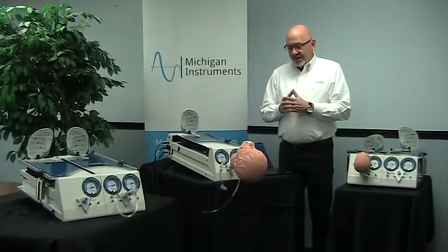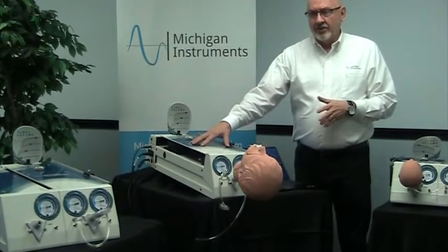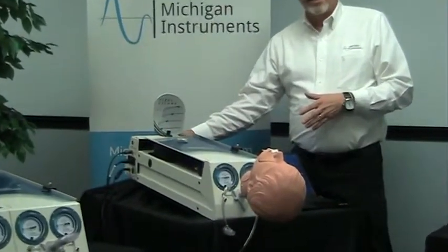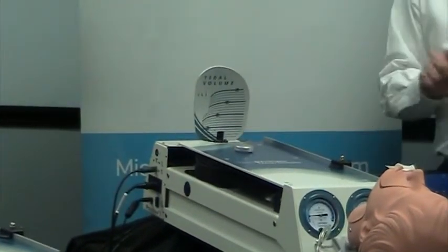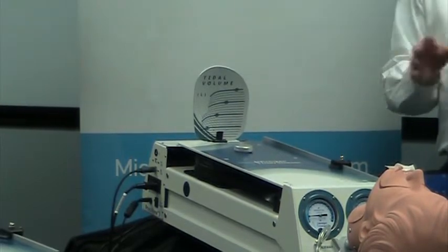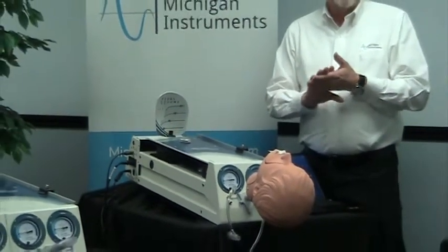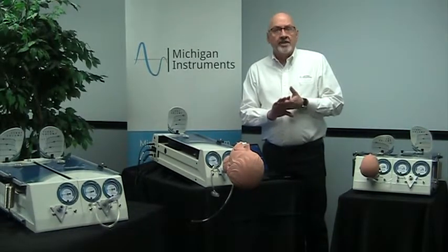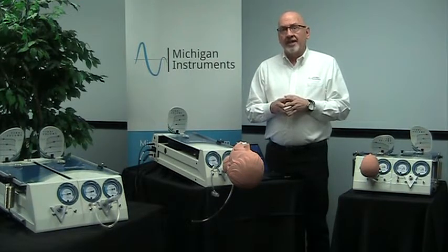The SBL, spontaneous breathing lung, incorporates the Michigan Instruments TTL or NuView test lungs and an SBL module that is mounted into those units. That SBL module can be mounted at the time of purchase, so you can receive any of our models with an SBL, or you can have it retrofit as long as you're working with the current generation — that's generation 3 — TTL or NuView system. If you have questions about that, contact us and we can let you know whether your unit is eligible for that upgrade.